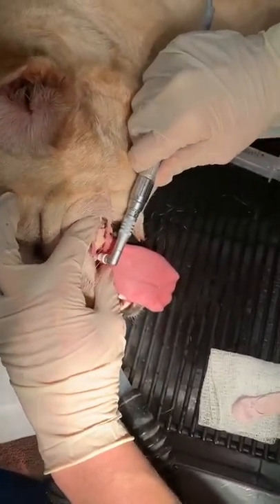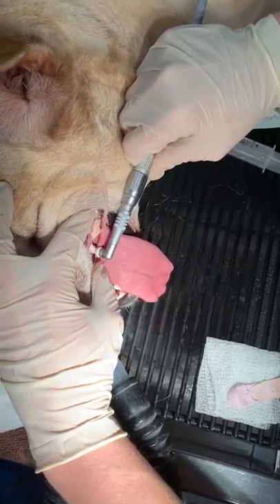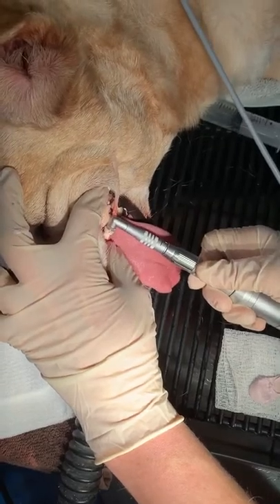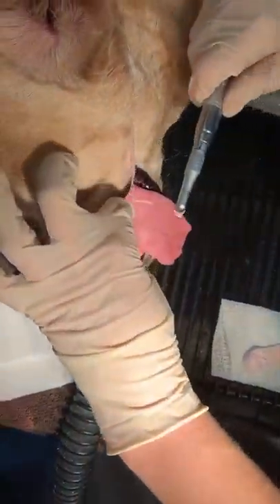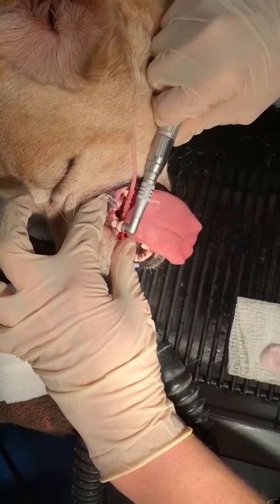I keep videoing your finger instead of the polisher. Now I should be grabbing a little bit more polish than I just did there. I want to refill the cup on this polisher about every tooth or so, just to make sure there's enough and plenty to go around. Trying to get all these different angles.